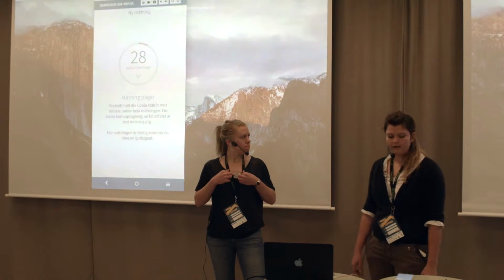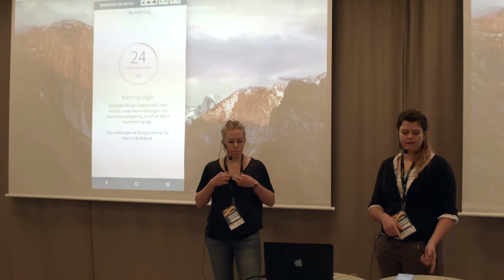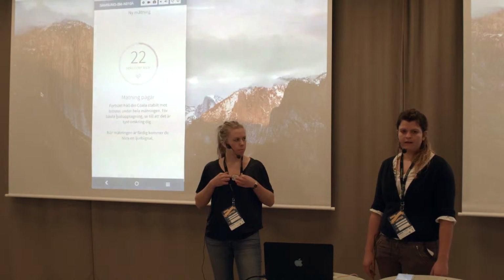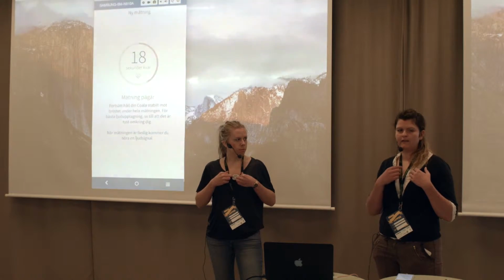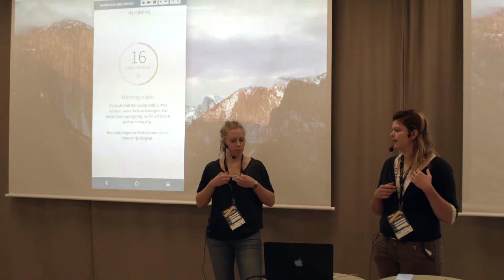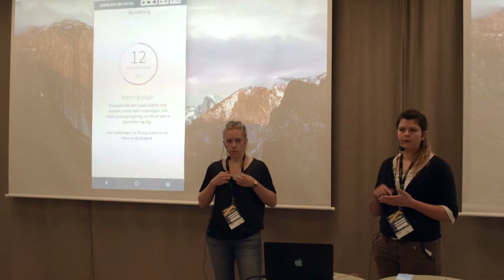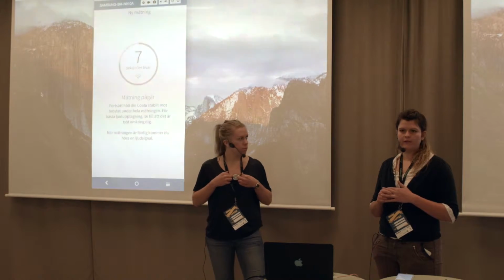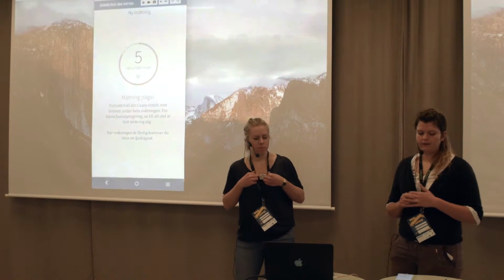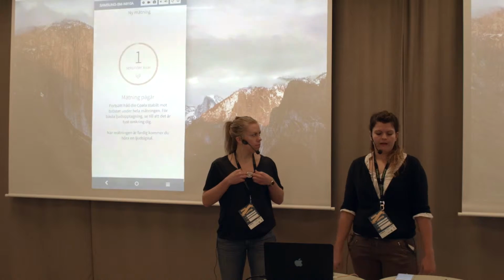Right now we have a classic Bluetooth connection with the application. It sends electrocardiogram data from the electrodes on Linda's chest, and it also has a microphone behind the membrane, so it actually works as a stethoscope as well. So we're recording her heart sounds now too. It's a lot of data transferred to the application.